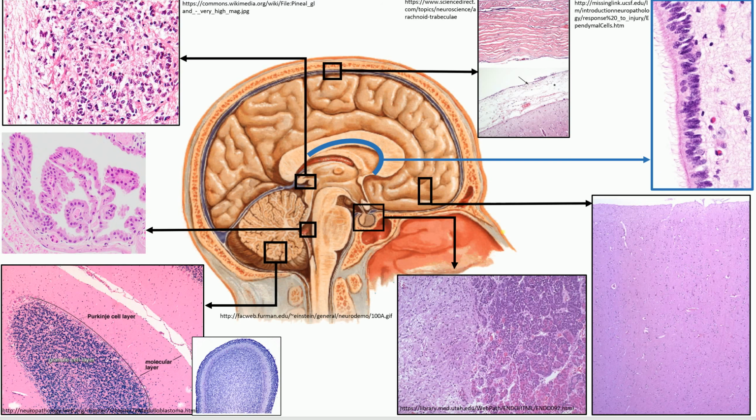And then the cerebral hemispheres compared to the cerebellar hemispheres, which can give rise to medulloblastomas. So the wide variety of normal morphologic histology that can be seen in the normal brain gives us an idea of the complexity of the different parts of the brain working together. And tumor progression in any one of these areas can give rise to very different looking tumors that are very different from each other. So this is our whirlwind tour of the different histologic appearances of the different parts of the brain and how they can give rise to very different appearing and different acting tumors of the central nervous system.